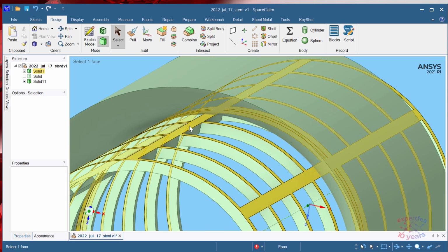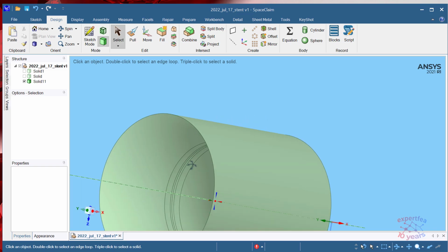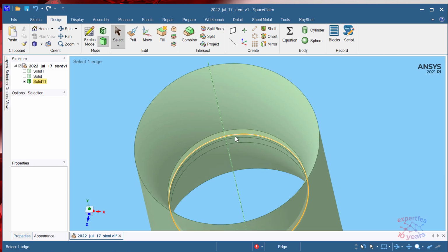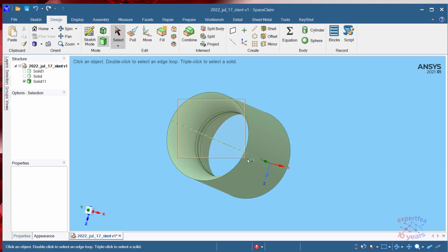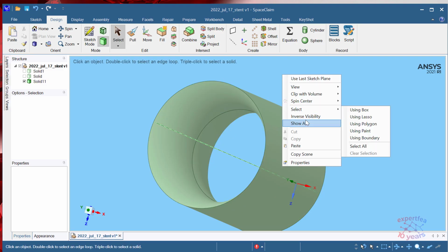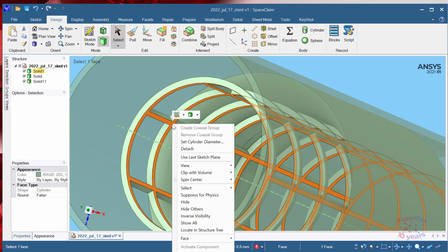I will hide this stent in order to see what occurred here. The stent now is somehow imprinted on the plaque. Let's select all these faces and just hit the delete button. Everything is round now. Let's also look now on the stent, what occurred on the exterior side.